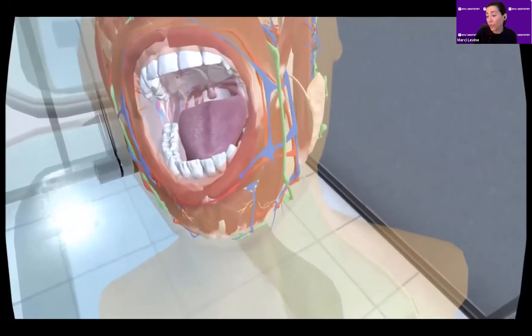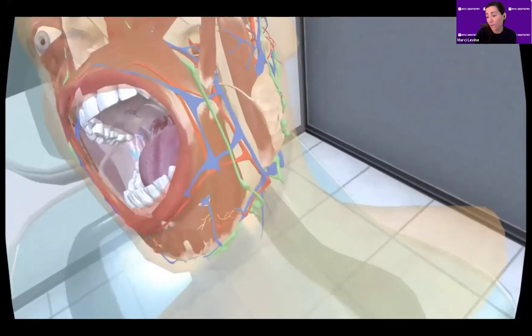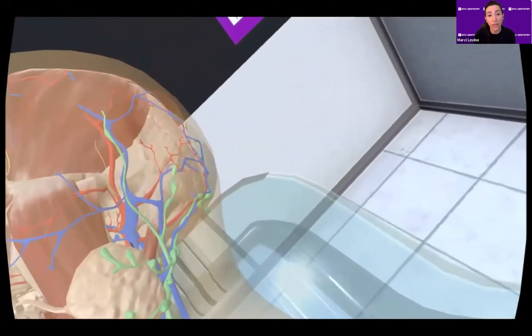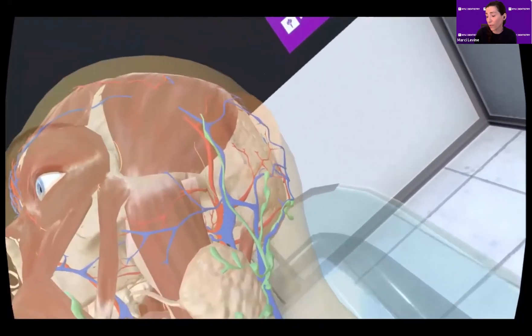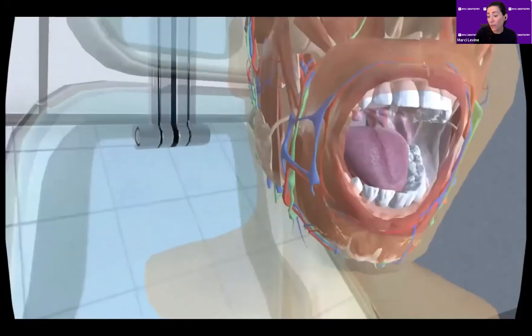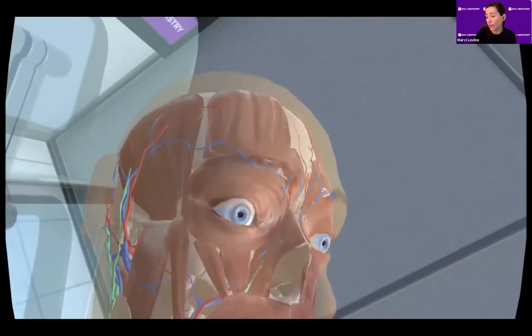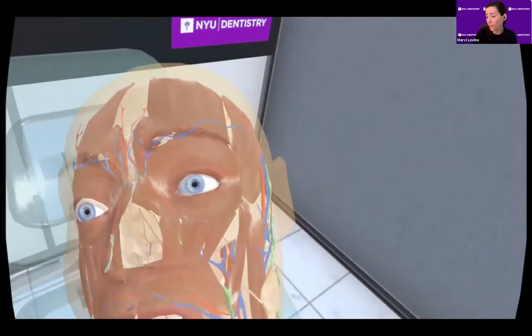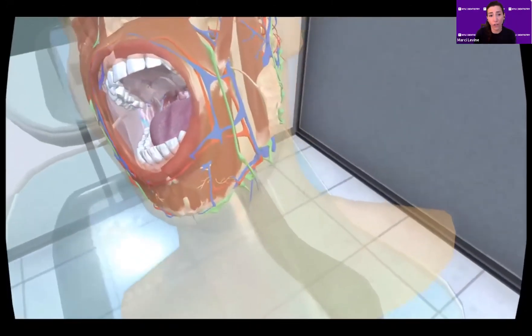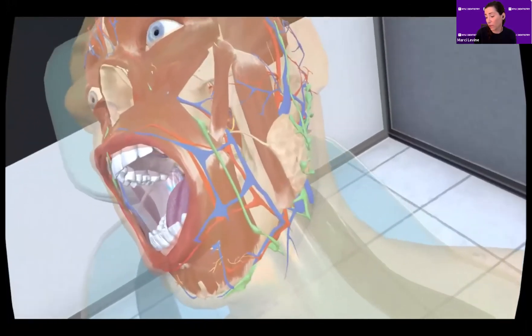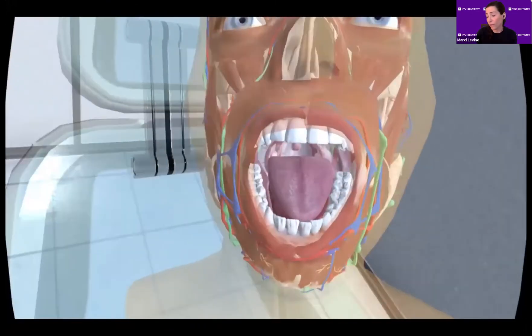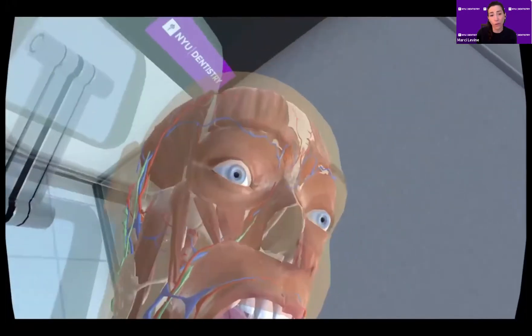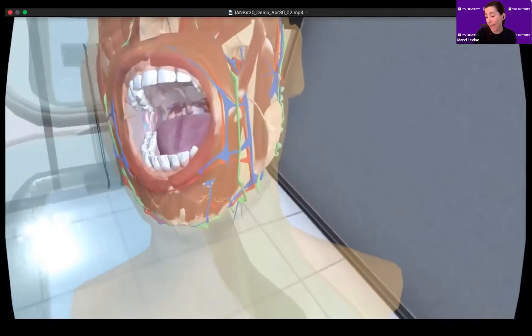The hands you see represent the student's hands. The module includes detailed layers of anatomy, and students can control the layering themselves with the hand controllers. Some anatomical structures can be labeled in this module, but for a more thorough review of head and neck anatomy, we will use a commercial 3D anatomy atlas.